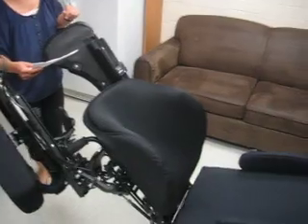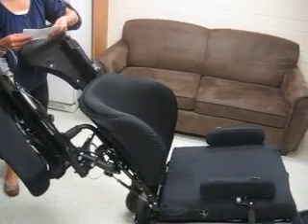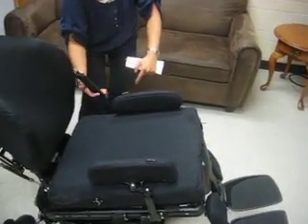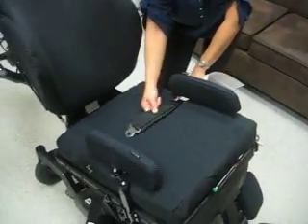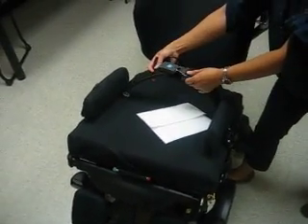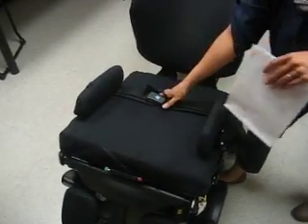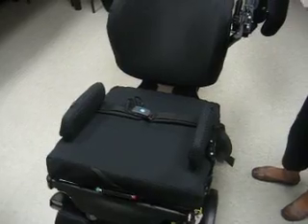Remove the sling. Apply the seatbelt. It needs to be slipped under the adductor pads and connected over the top of the thighs. The seatbelt should not be high up on the hips.